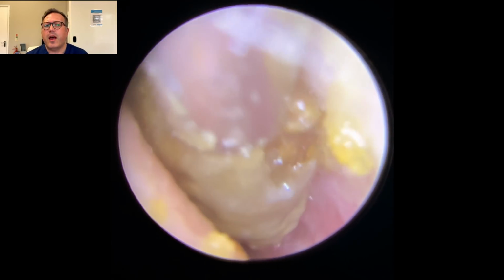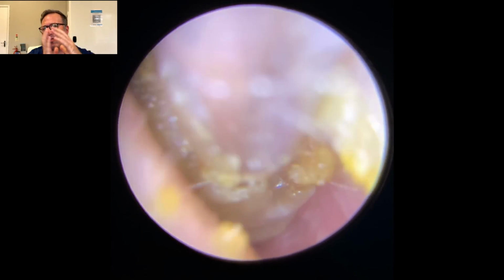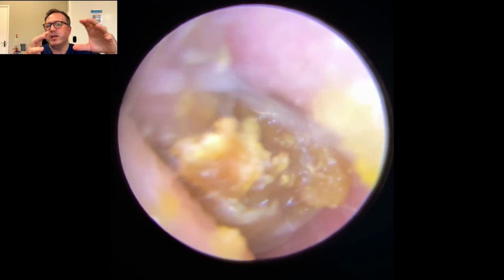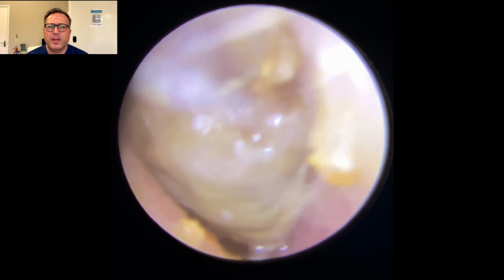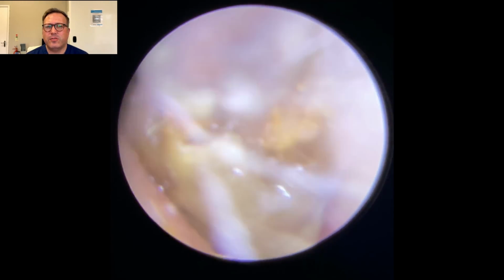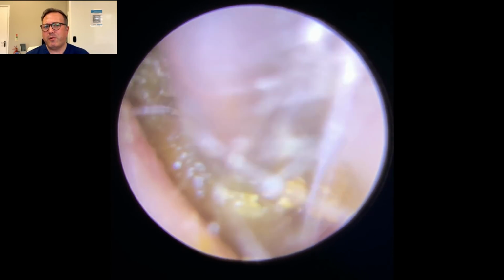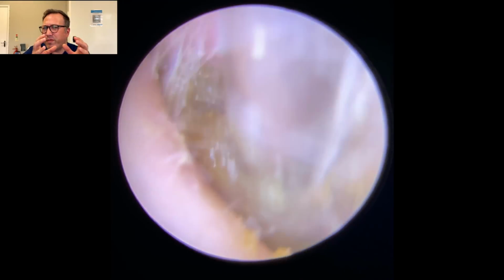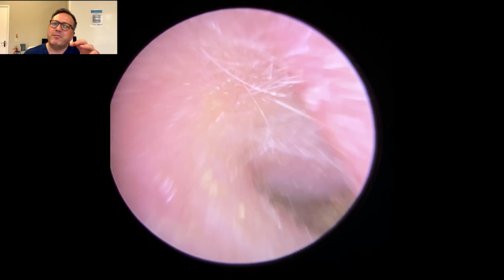The difference in shape and canal, the entrance here is very narrow. You've got this wider section behind, so you're trying to pull this wider section through a much narrower gap. It's almost there. It's not going to work out easily, okay? I'll try and wiggle it now in the canal. Sometimes you can just move it enough and kind of shimmy it back and forth to be able to pull this out. But as you can see there, it's kind of wedged.